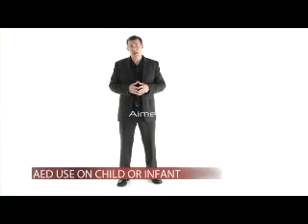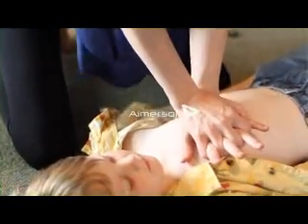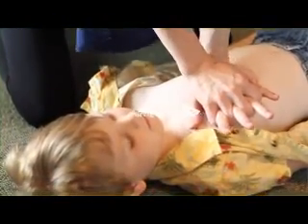If a victim is older than 8, always use adult AED pads and settings. For a victim younger than 8, use pediatric pads, a key, or switch. Make sure the pads don't touch each other. If it is not available, use adult pads and settings.